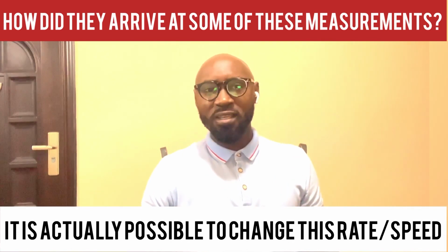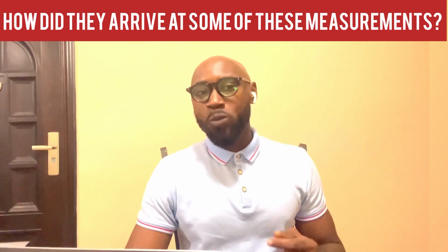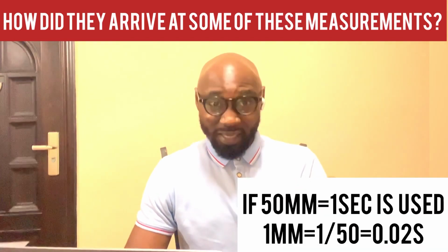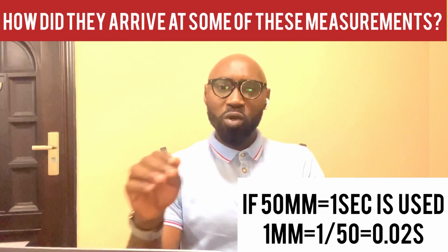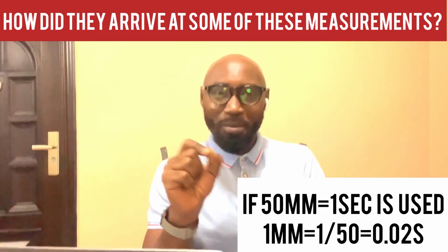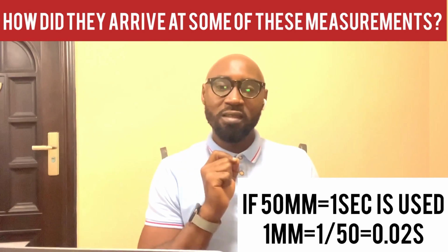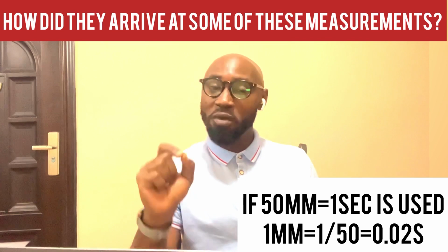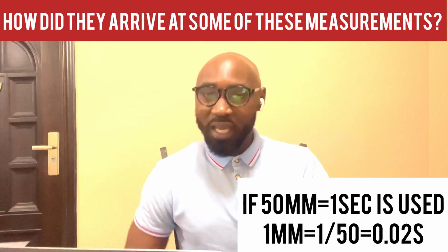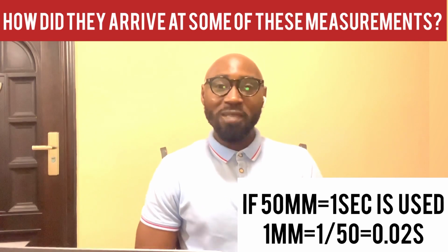paper output speed. So for example, if we were to increase the paper output speed to a rate of 50 millimeters per second, then by simple proportion, we expect that one small box on the horizontal axis that measures 1 millimeter will no more be equal to 0.04 seconds, because we will not be dividing 1 by 25, but one small box will be equal to 0.02 seconds, because we will be dividing 1 by 50. That is by simple proportion.